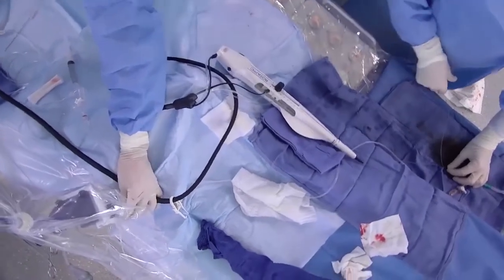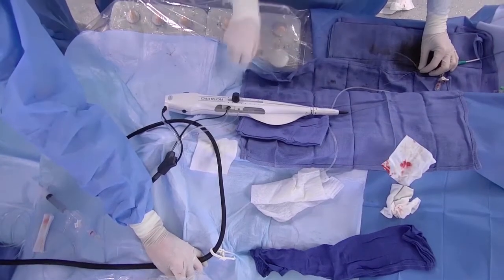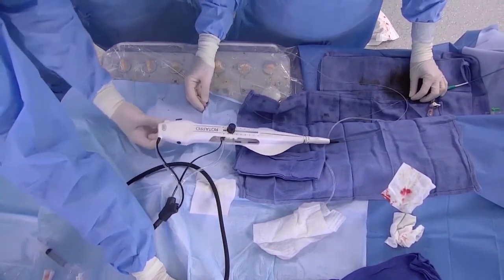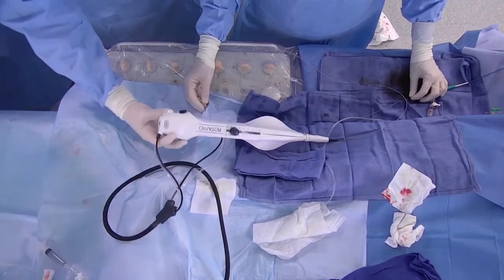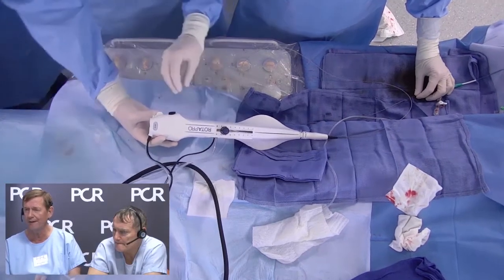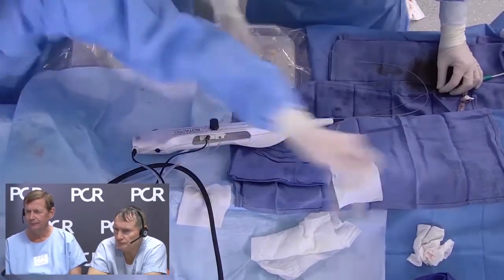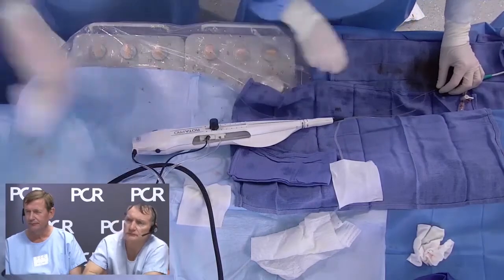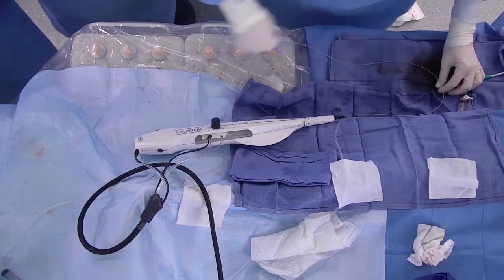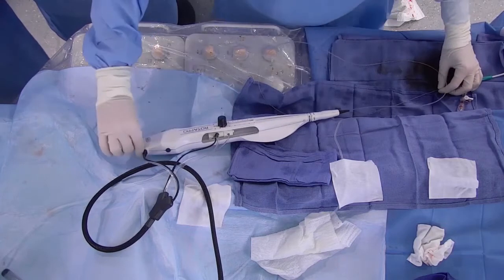Please go ahead, Adam. There's a little space to park the brake in the back. They had it on the old system as well. Yes. Not everyone uses it because sometimes it does cause a kink in the wire, which of course you need to avoid. But if you do it very carefully, it is quite convenient. So this is my technique, but we can discuss. A lot of people have different techniques. Just to show what I do, I do a loop with the burr and I pull the wire, and thanks to that I can advance it.